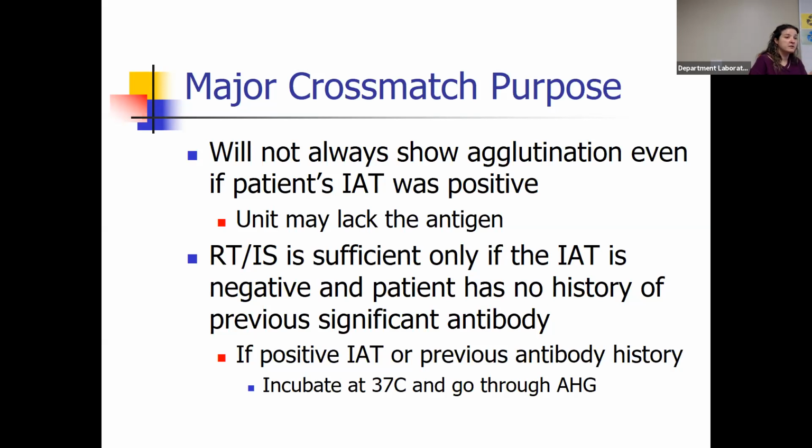Anti-M is another one. So if your patient has IgM anti-M, and it's reacting at initial spin but warms away at 37 and AHG, and your unit is compatible, that one is deemed safe as well. But if it's reacting at AHG, then you must phenotype. So there's a lot of things you have to think about. There's a lot of circumstances. There's always exceptions in blood bank.